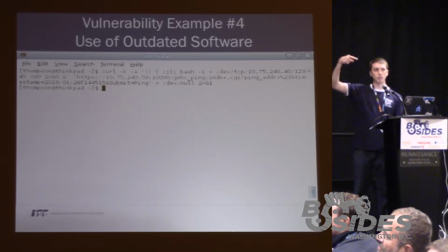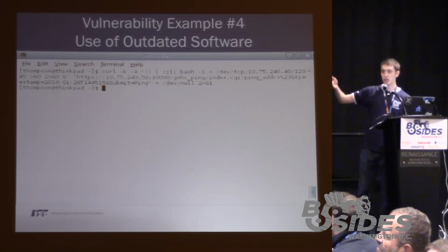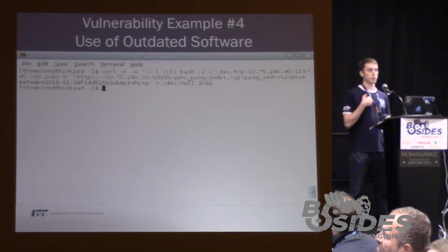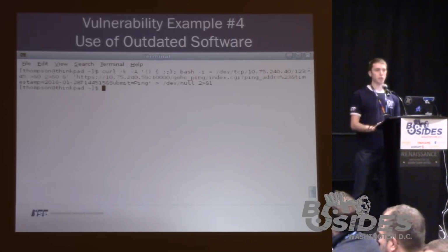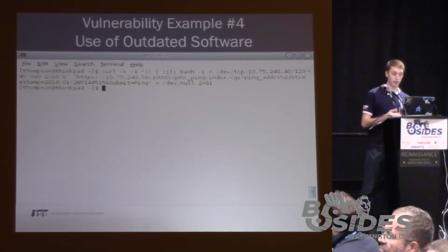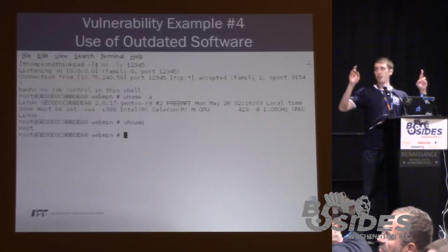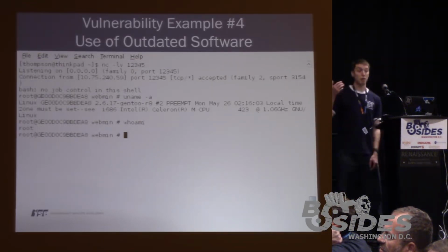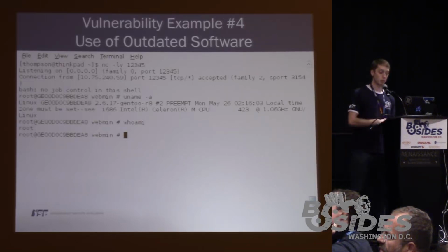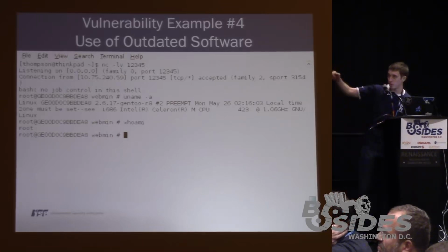If you notice the redirection, we're going to read in from /dev as the input to the bash interactive mode. The /dev is actually going to make a connection to us, because we're going to use a TCP device to connect back out to us, and then use some input redirection to be able to interact with this shell in interactive mode. So we send this to the server, and fingers crossed, bam, reverse shell. We were able to compromise this device without authentication from a remote perspective using a well-known vulnerability. As you can see, we have the shell, whoami, root.